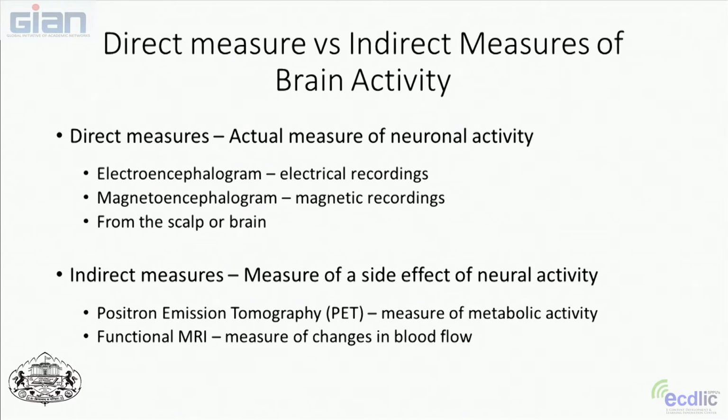And we measure these, of course, from the scalp. In some cases, EEG is measured directly on top of the brain when they're looking especially at clinical cases of epilepsy. We're going to distinguish those direct measures from indirect measures.